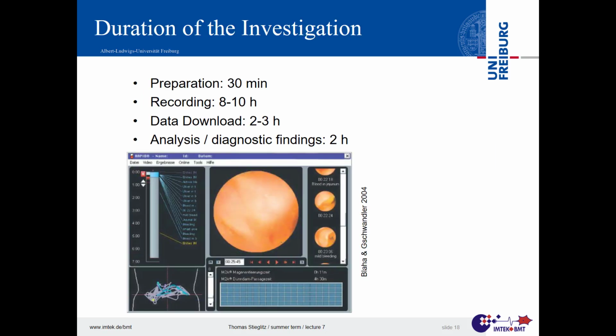This is here a detailed plot where I can say, oh, this is the picture that I have. This is the previous and the next picture, just in case you see transitional changes of whatever inflammation, for example, in there. You have the passage and the trajectory with a marker where the system would be in there. And this has been done in close collaboration with the medical users to make it in a way that they're happy to use that and that it is kind of intuitive.